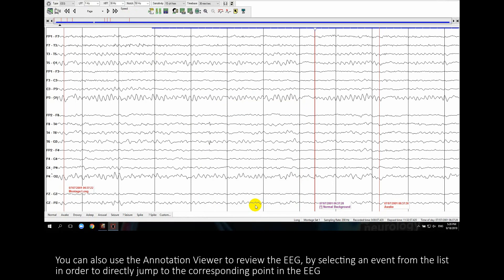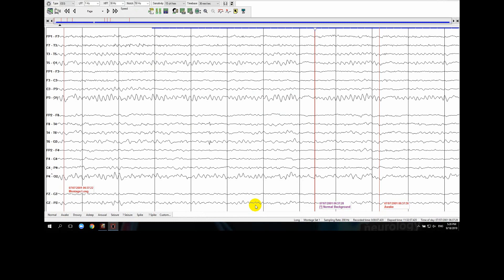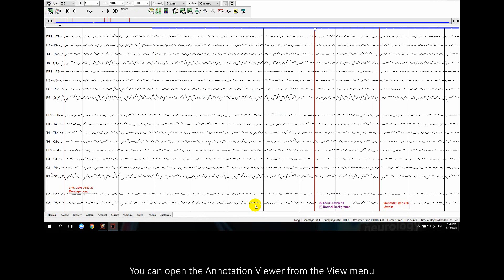You can also use the annotation viewer to review the EEG by selecting an event from the list in order to directly jump to the corresponding point in the EEG. You can open the annotation viewer from the View menu.